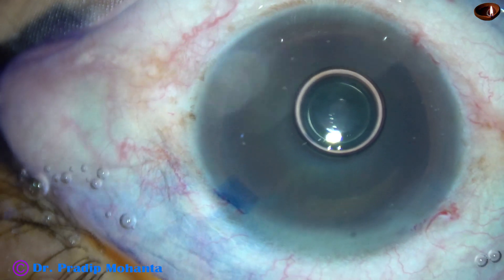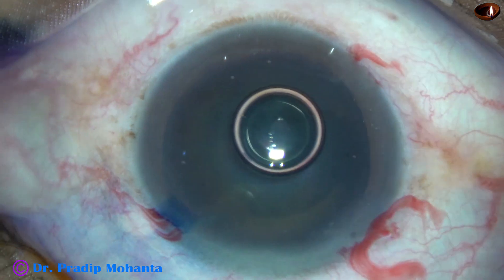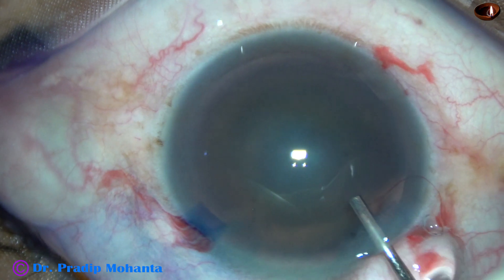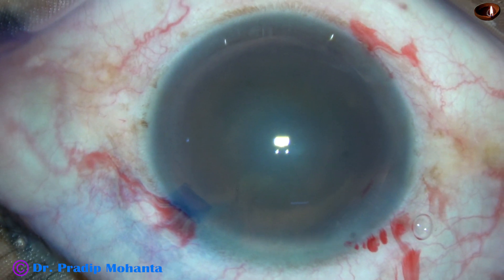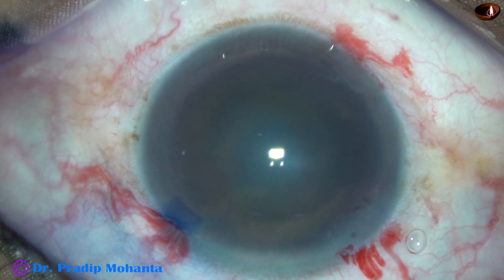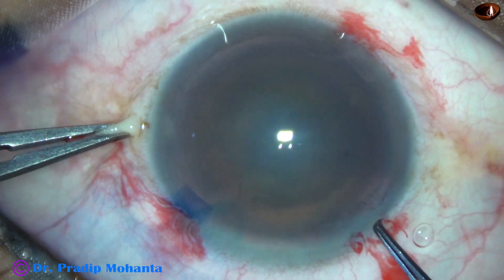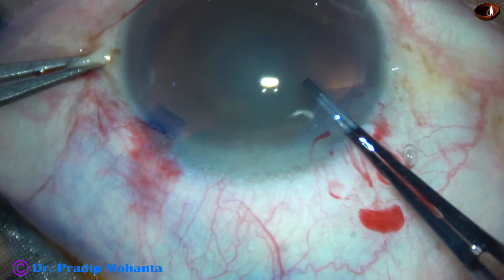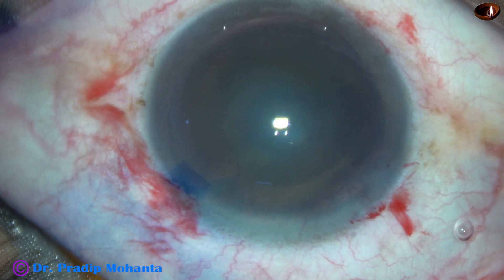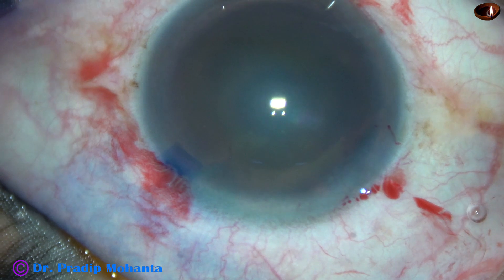And now we are going to do capsulorrhexis with utrata forceps. Whenever we do capsulorrhexis with utrata forceps, we must remember that we must lift the anterior lip of the main wound, keep the anterior lip lifted up, and rotate the utrata to do capsulorrhexis. The tip of the utrata is lifted up like this — if we press on the posterior lip, there is leakage of viscoelastic. So we must keep the anterior lip of the main wound lifted up.